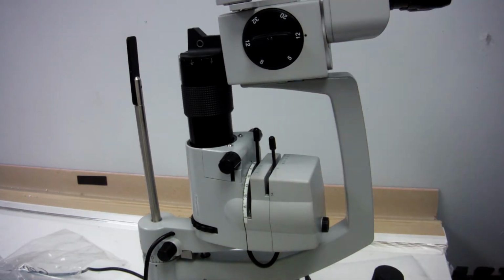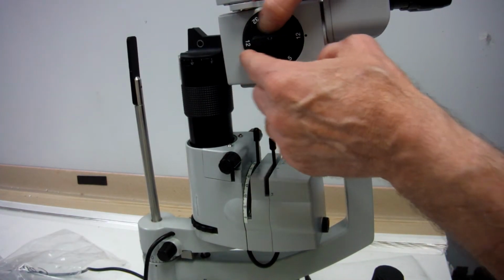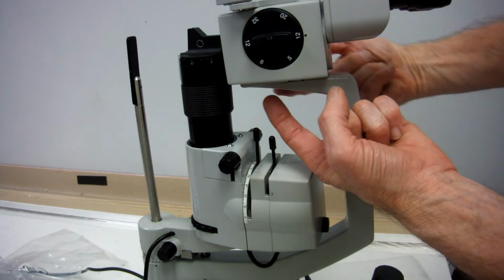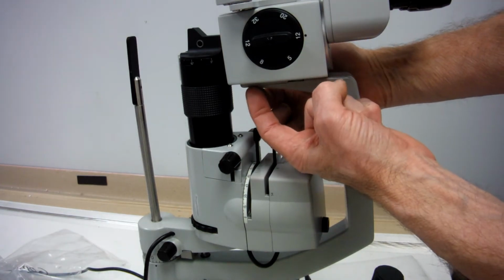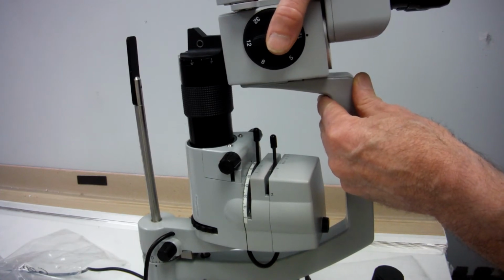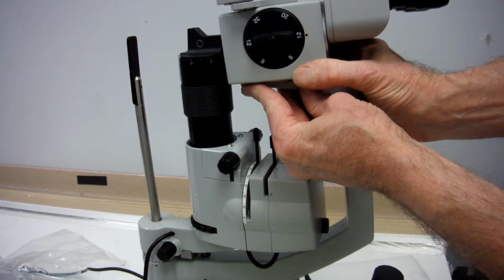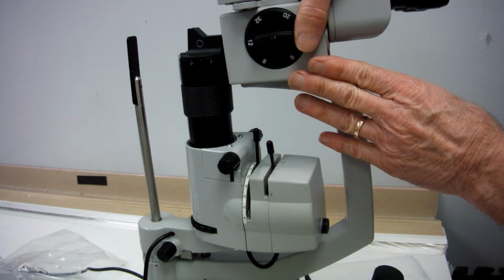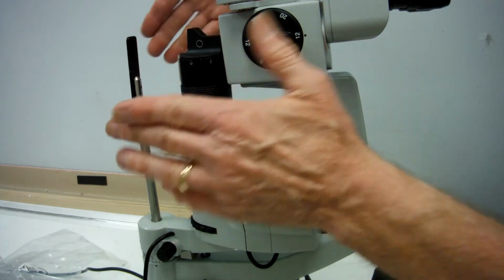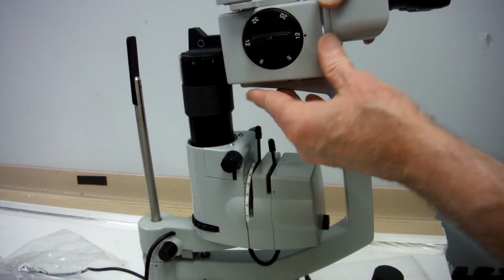Now, if when you look through originally, when there's no lens on your mag changer, it's not centered, you're going to have to loosen these two screws under here, under your head, so that you can turn your head. Don't get them too loose or else it will move a lot. So just loosen them enough to move, and you can turn it one way or the other so that the space on either side of your focusing rod as you're looking through your view is the same, center.